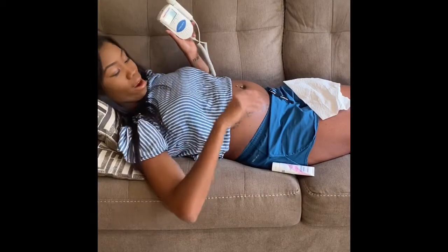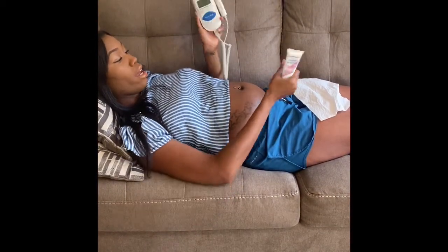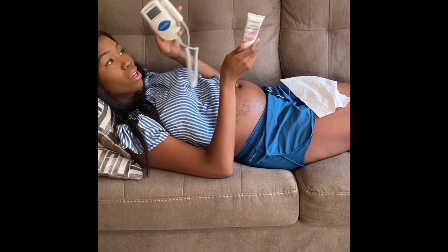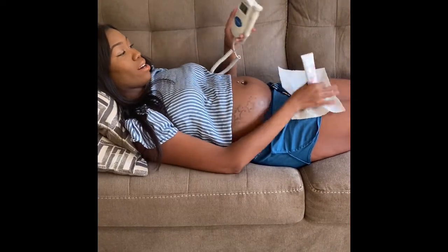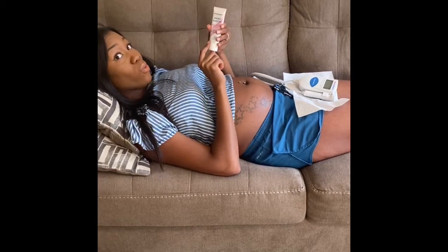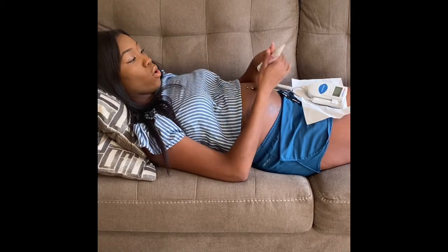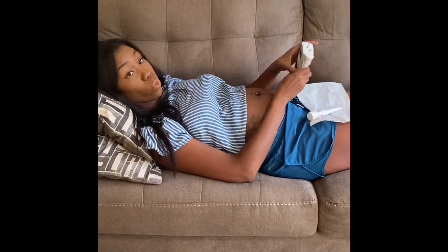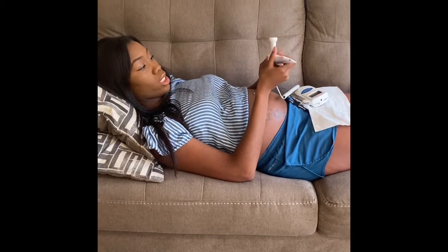All right, so we are back, and we are about to try the SonolineB baby Doppler. You have your gel, the Doppler, and I would suggest having a paper towel handy because it does get a little messy. I've used quite a bit of this, but if you do run out, you could just get aloe vera gel from your local CVS or Walgreens or wherever you choose to go. It's not a big deal. It works just the same.